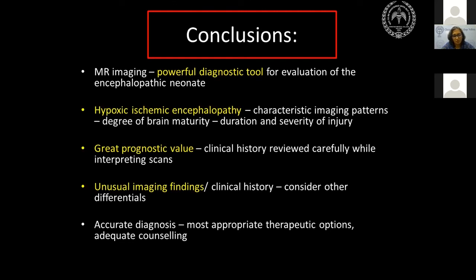While carefully reviewing the clinical history and interpreting scans, if there are any unusual imaging findings, go back to the clinical history, as we need to consider other differentials. Accurate diagnosis is very important to provide the most appropriate therapeutic options and adequate counseling.